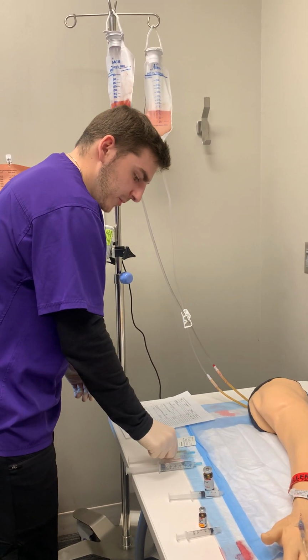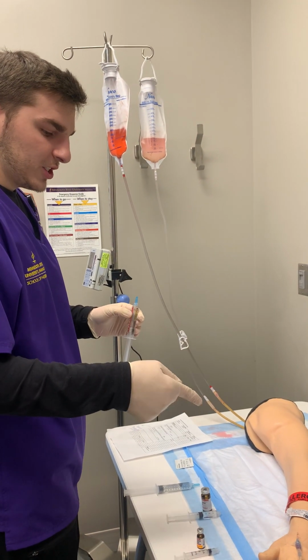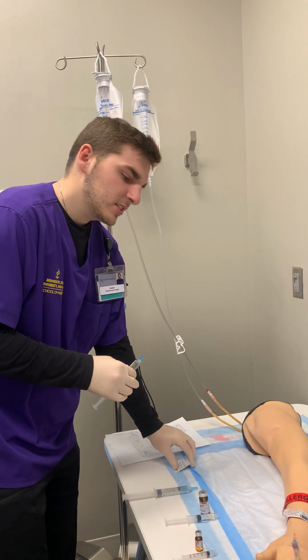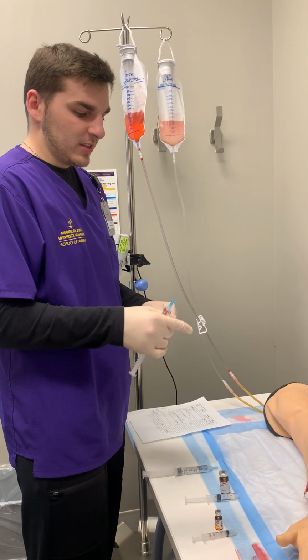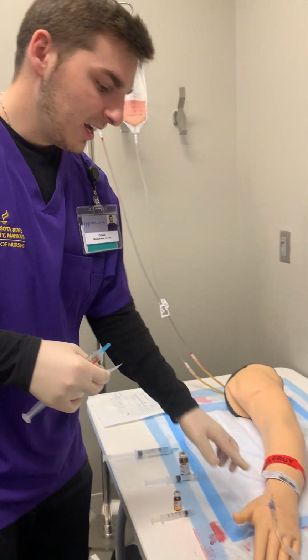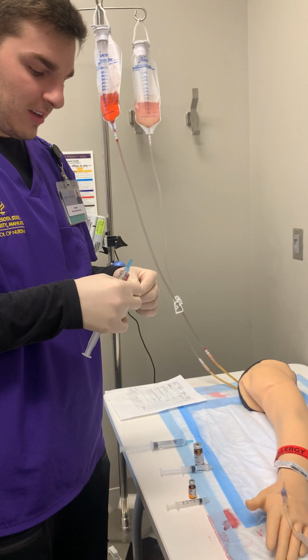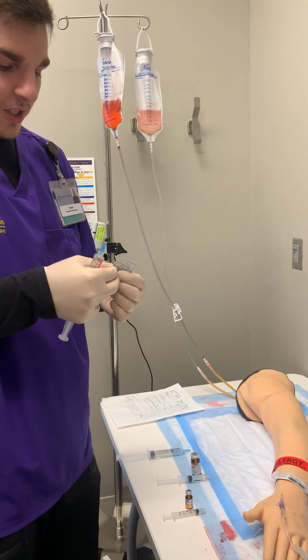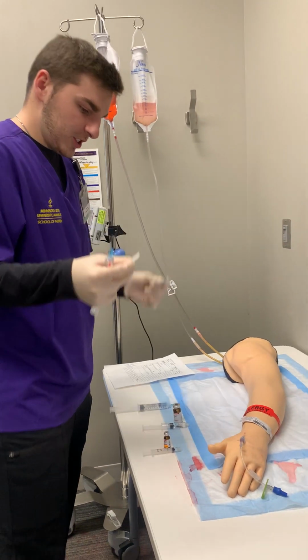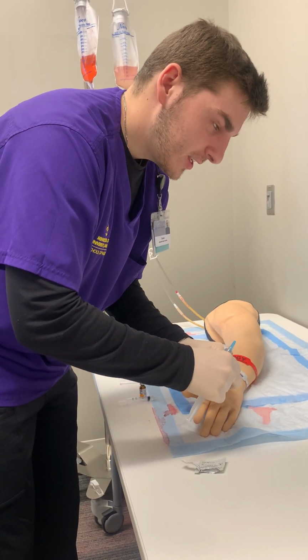But first, I'm gonna take some of this normal saline, which is just fluids, and I'm gonna check your IV site, just make sure it's patent, okay? And that just means make sure that it's able to flow. And on this dummy, the IV site's actually bent over, so we can't actually push anything. So I'm just gonna, for simulation, pretend that I can push it. All right, so first I'm just gonna scrub the hub for 15 to 30 seconds.